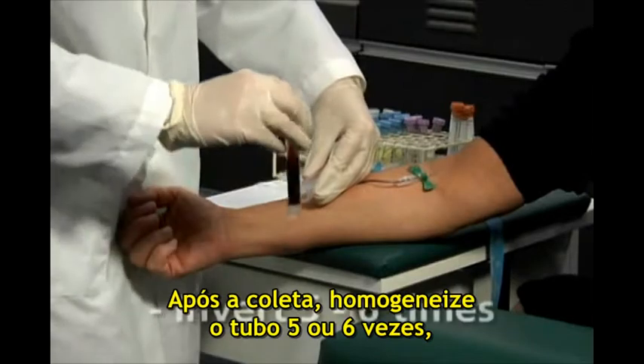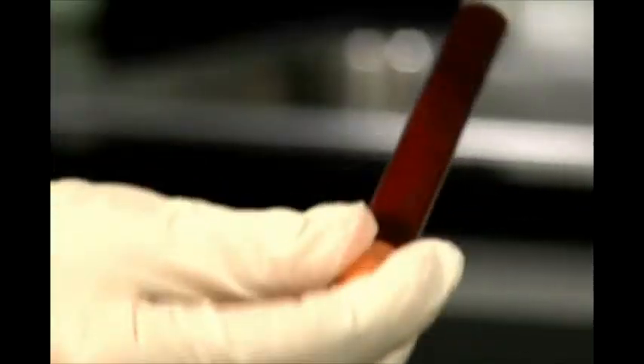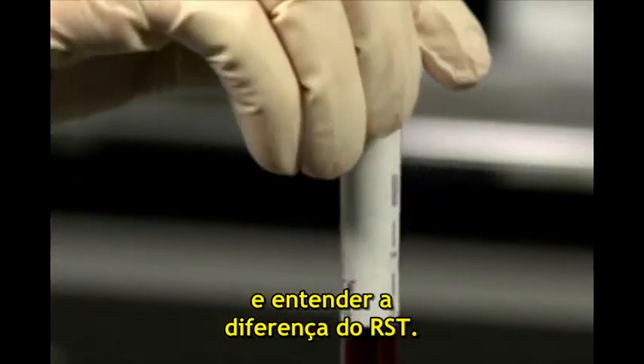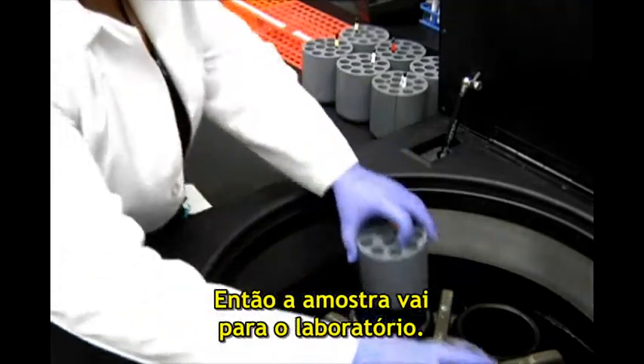Following collection, invert the tube five or six times to help mix the clot activator with the sample. As you invert, you may feel the specimen begin to clot, and you'll begin to understand the RST difference. Next, the specimen goes off to the lab.